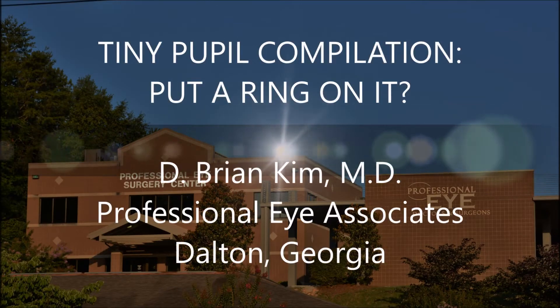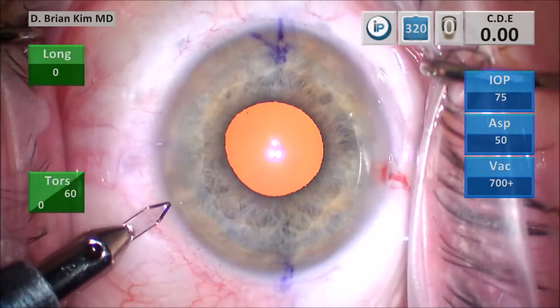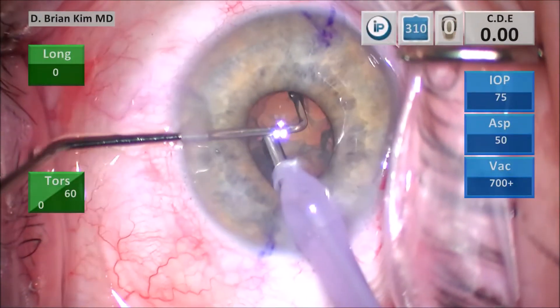Hi, this is Brian Kim and I'd like to share with you my routine approach on dealing with the tiny pupil cases. I like to perform a mechanical fracturing technique for my cases and I'll show you how I can do this on small pupils as well.